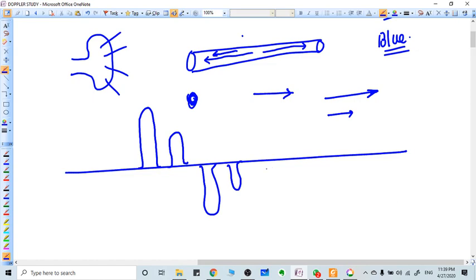If we see above the line, the waveforms are because of the flow towards the probe, and the waveform below the line will be formed depending on the velocity of the flow. The size of that particular curve will change. The more curved, the more velocity. Okay, you need to remember this one thing.